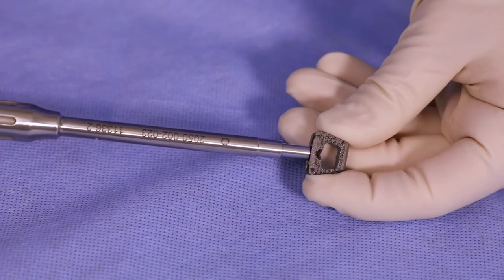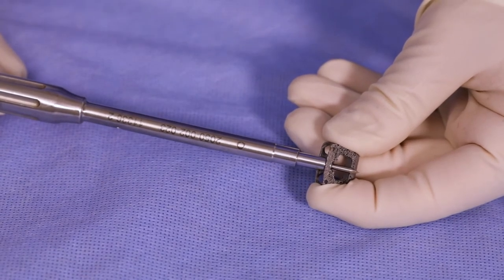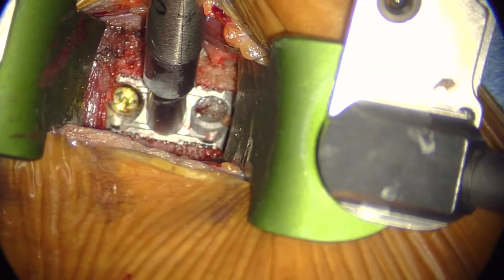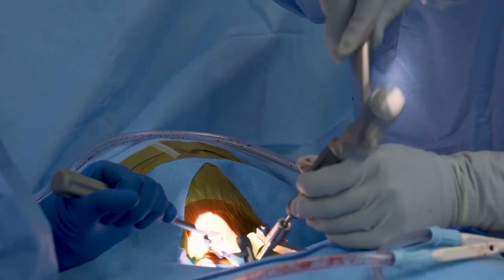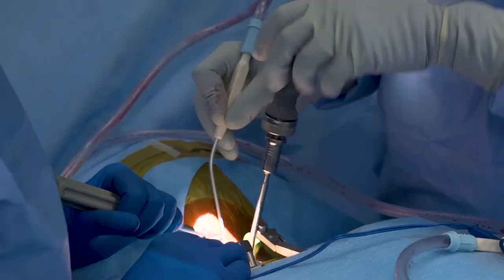The straight punch awl is self-guiding. Simply dock in the screw hole and provide a forward twisting motion to create your pilot hole. Proceed with the proper screw length to secure the implant.